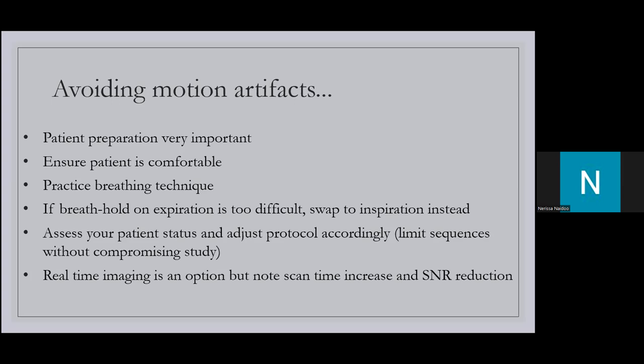Again, assess your patient's status. If you see they are really not in a good state, they are really short of breath, they are in too much pain, then you can adjust your protocol accordingly. This is where it is important that you work as a team with your cardiologist and your radiologist. You can look at the clinical indications.